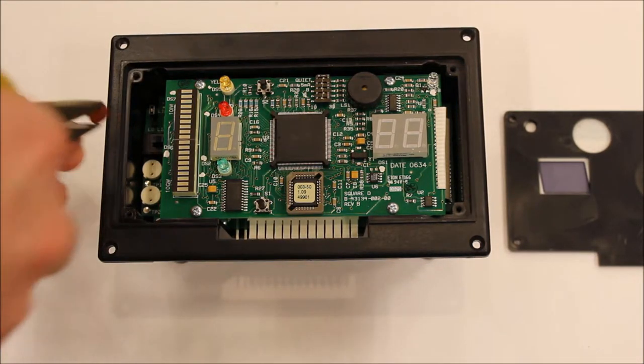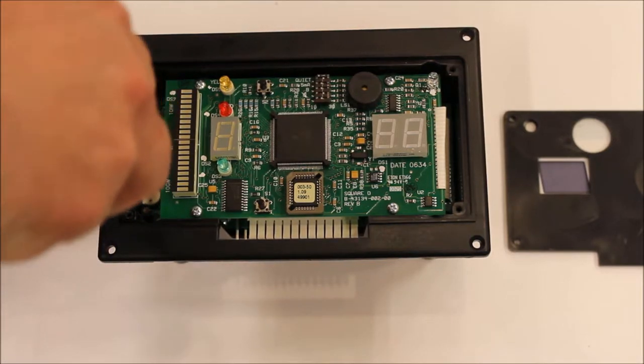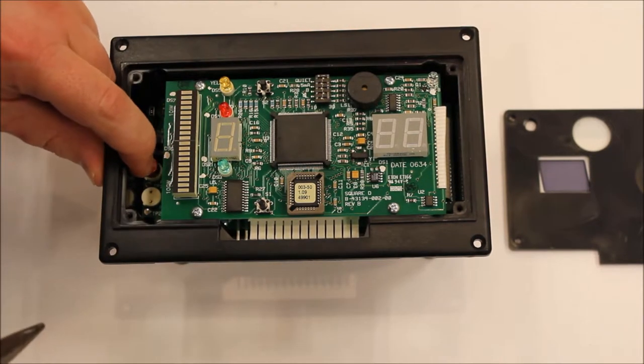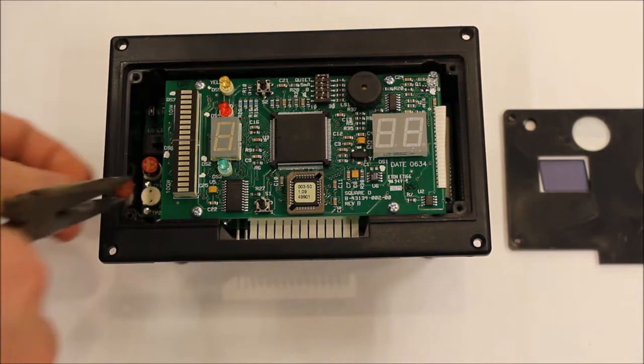Using needle nose pliers, carefully insert the new fuses, making sure they're fully seated. Our published literature identifies the fuses as Wickman TR5T, 250 milliamp fuses.